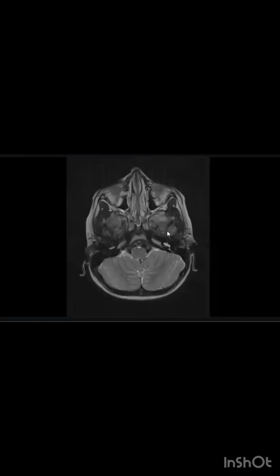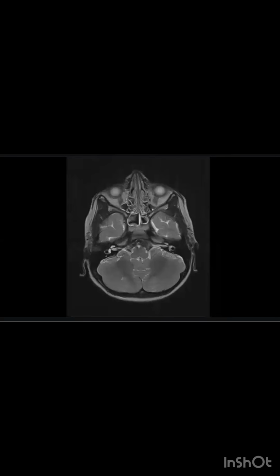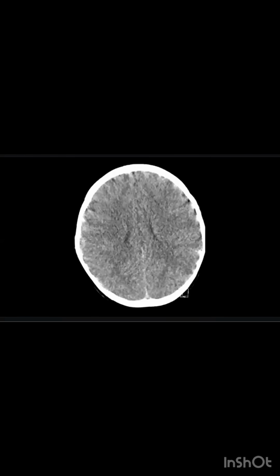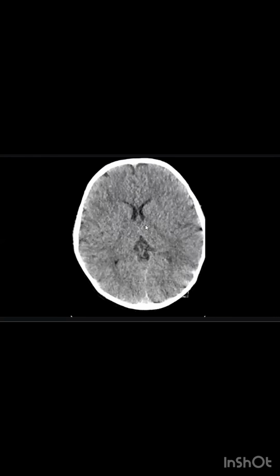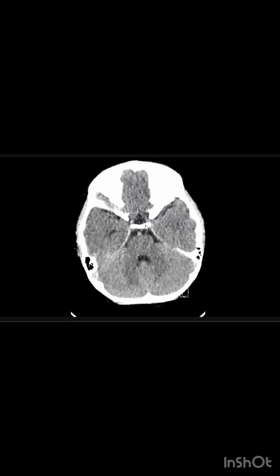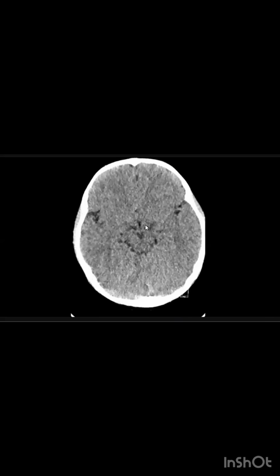Candidate 3. Yes, doctor. Yes, we give you CT. Okay, not all CTs will come back abnormal, but if the patient is unwell and the clinical history is not going with the image, we will not let the patient go.